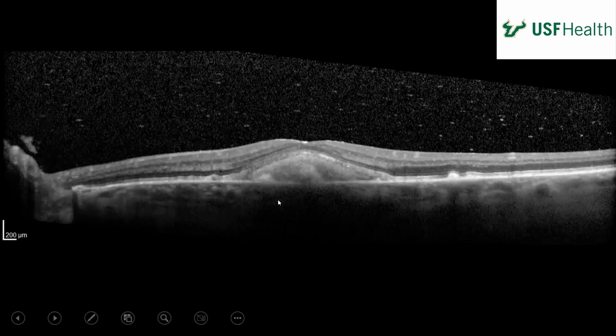All right. And then this is the other eye. Fair enough. So we have an OCT of the left eye. We have another, for now I'll call it deposit, directly subfoveally, causing the entire neurosensory retina and overlying retina to be pushed anteriorly just above the RPE there. We also see a couple of other similar deposits scattered along the OCT in both directions from the fovea that we saw in the right eye OCT as well.